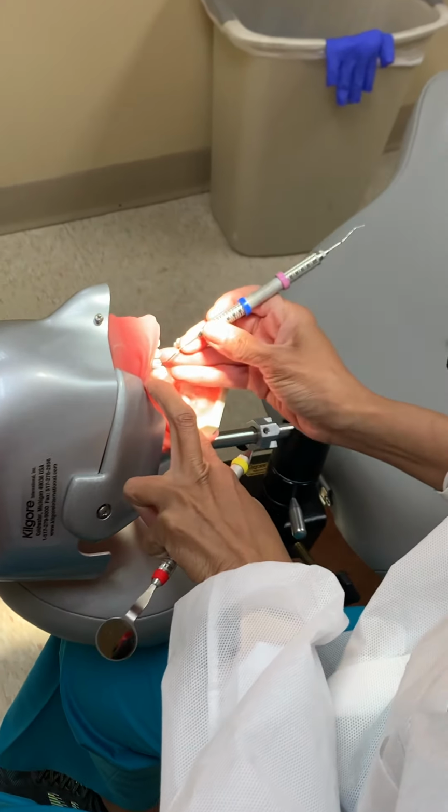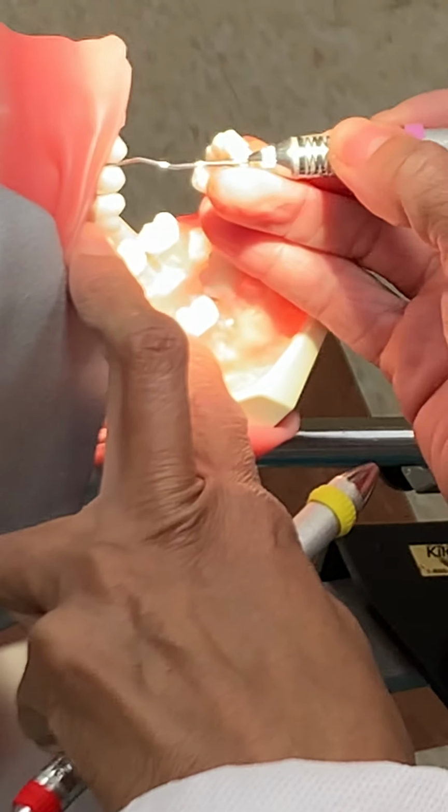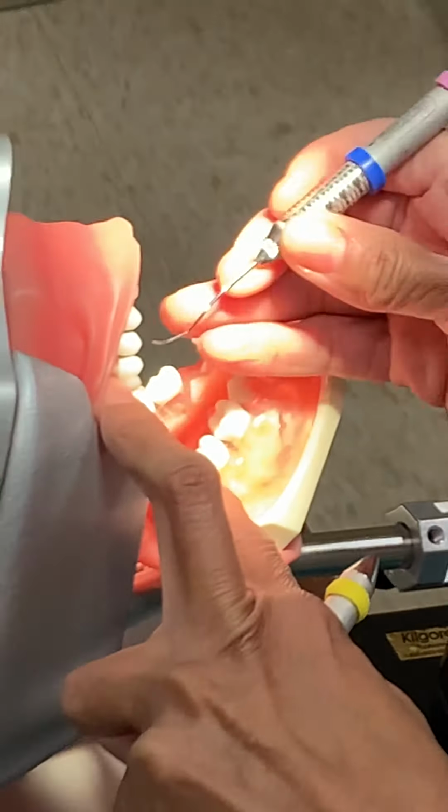Interproximal, you've got to have your fulcrum. Like I said, you've got to have a fulcrum. You can't just get in there like this. You can make it parallel even if it's the wrong end if you don't have a fulcrum, and it's not as bad. But once I get my fulcrum, that's parallel. And if I have my fulcrum and I try to make it interproximal the wrong way, I have to be all contorted like this. So always establish your fulcrum first.